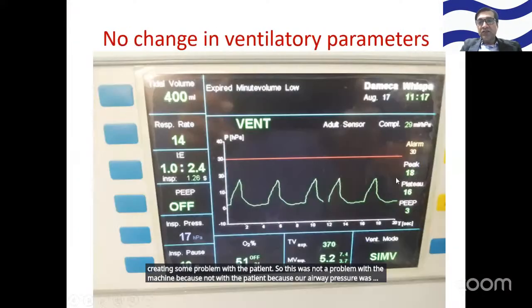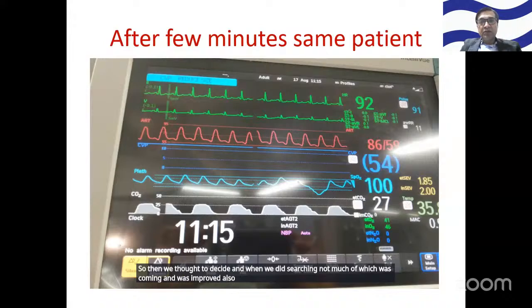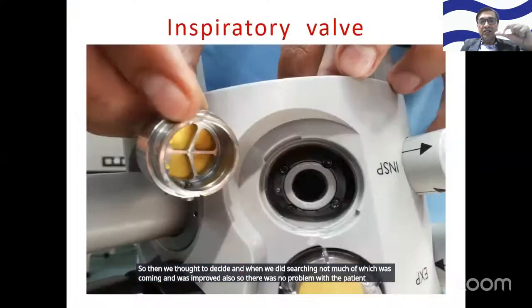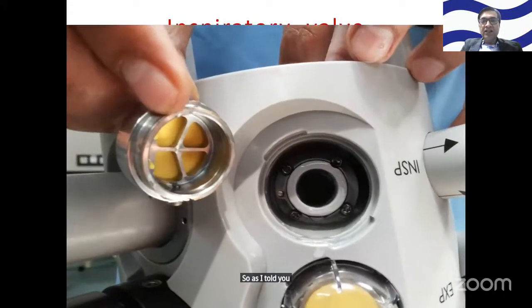So peak was 18, was maintained. Ventilator waveforms were also okay. So then we decided, and when we did suctioning, there was not much coming, and it was improved also. So there was no problem with the patient. So we thought, why not check the machine? And when we checked, this inspiratory valve had water droplets, and this was causing this kind of problem, right? So as I told you, from EtCO2, you can clinch the diagnosis.